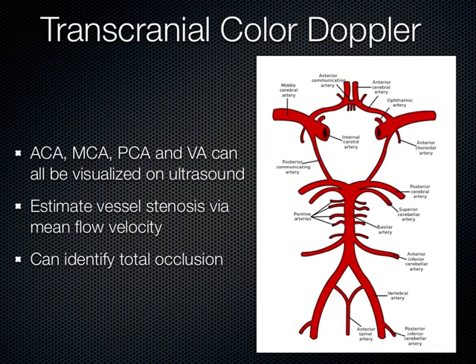So in terms of transcranial Doppler or neurosonology, you can actually make out a lot of the vasculature in the brain using ultrasound. Now, a lot of people don't know that because they think about the skull being in the way and reflecting the sound, but actually there's a few little windows where you can peek into the brain, and you can see the anterior cerebral artery, the middle cerebral artery, the posterior cerebral artery. You can also make out the vertebral arteries as well.